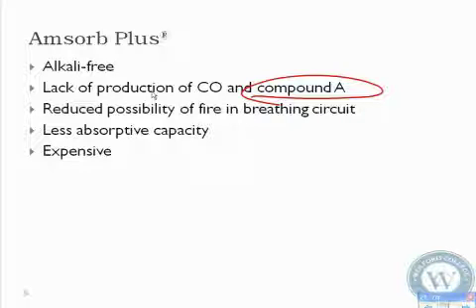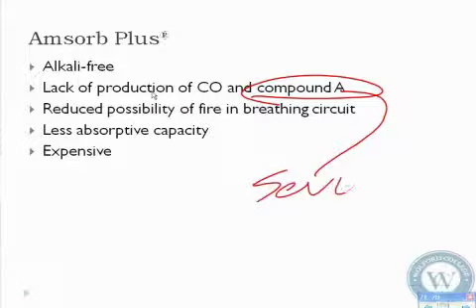compound A, okay? So compound A was formed, and these rats died. It causes liver or hepato and renal toxicity. Never been shown to happen in a person. But because it happened in rats, thanks to him, a long time ago, that is like a big warning that comes out with sevoflurane. And so compound A can occur with soda lime granules when flows are really low. Okay? So this happens with Sevo when flows, fresh gas flows, are less than 2 liters.